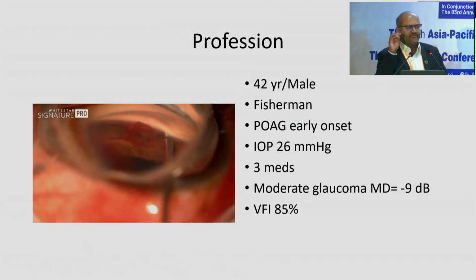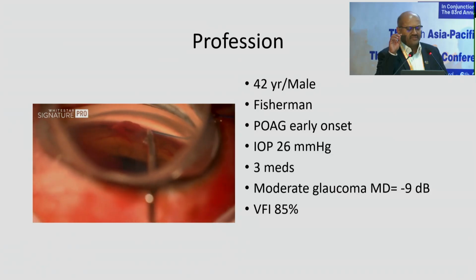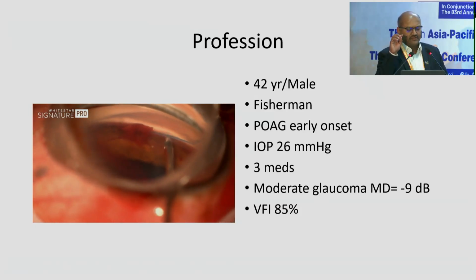As you see a blob of blood, that means the suture is coming closer and closer to you. So the suture tip, that is how you can know that you are almost at 360 degrees. You need to have about 25 to 26 strokes before you get the suture on the opposite side. So that's an indication that you are in the correct plane.